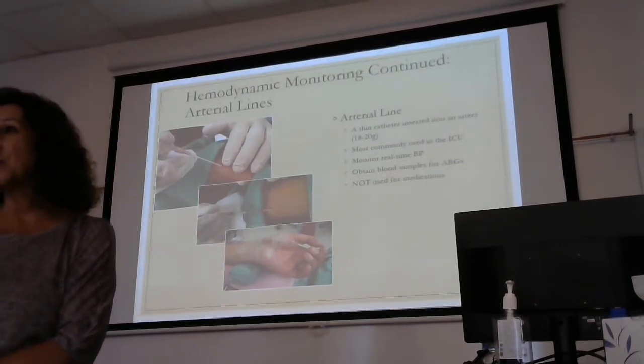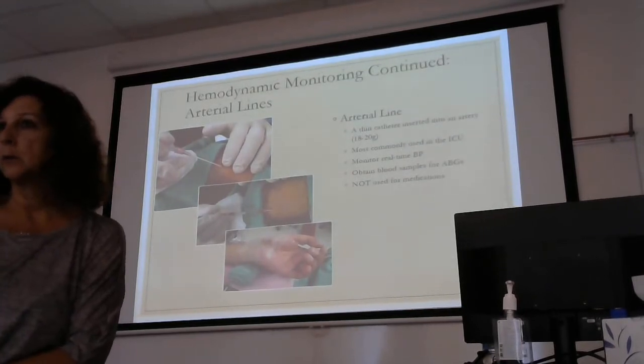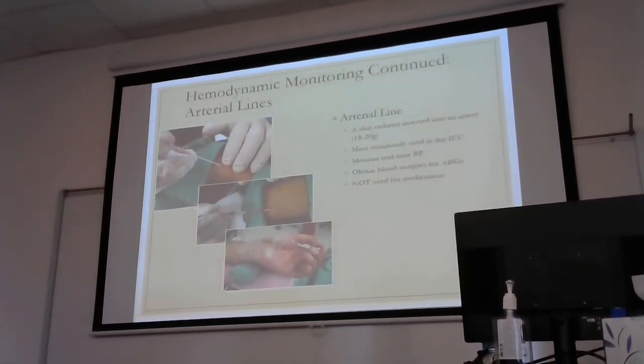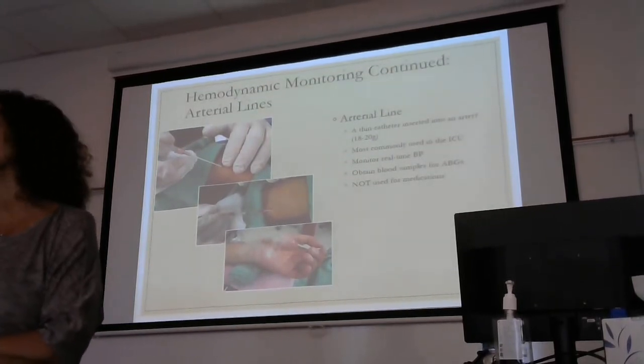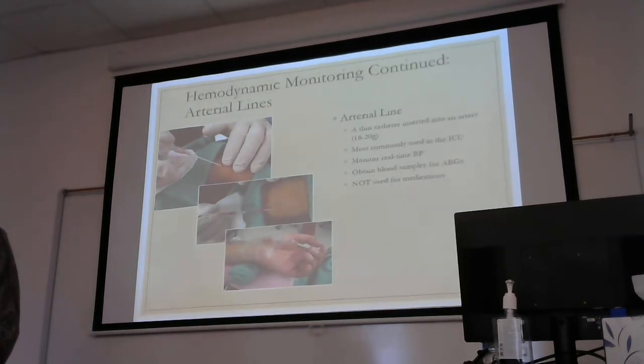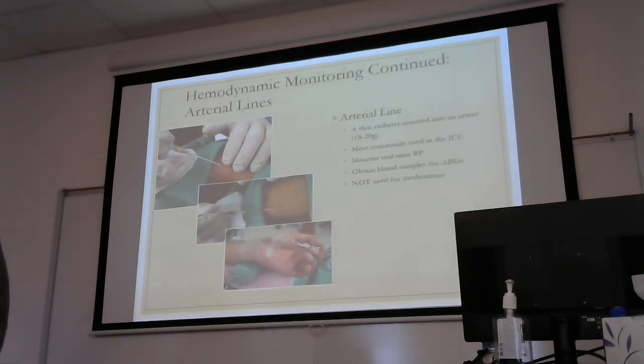People came in with the hand, they want to go back home with their hand. So we want to make sure we're monitoring distal perfusion. It should not obstruct distal perfusion. Am I going to be able to get a radial pulse here if I've got a radial A-line here? The answer is no. But what would I document to look for perfusion evidence? The temperature of the hand, the color of the hand, as consistent with the other, obviously, cap refill, etc.